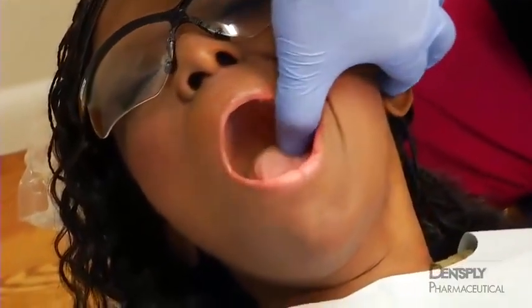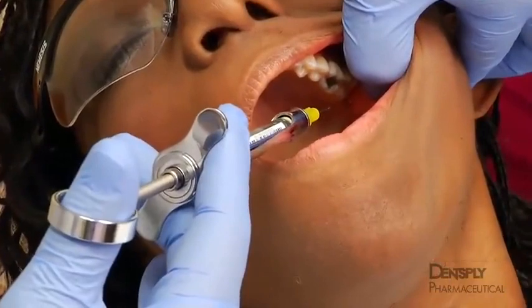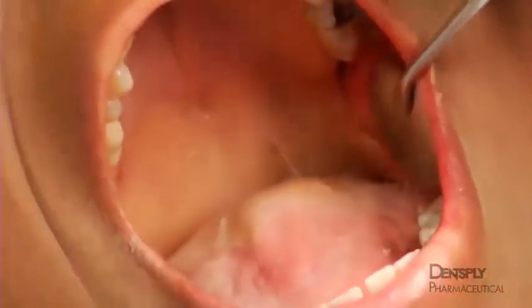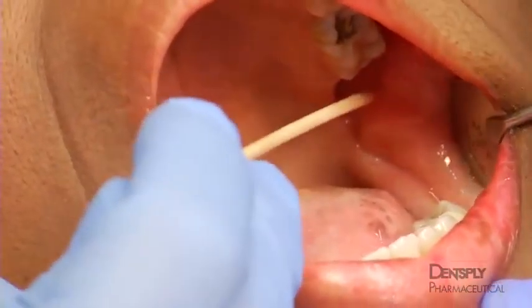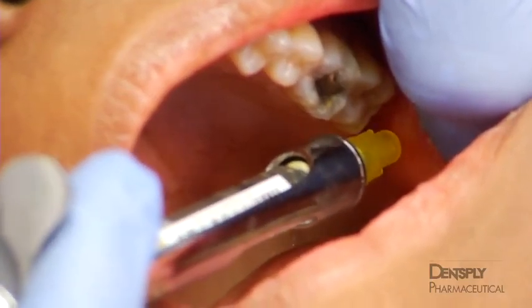With the syringe barrel over the contralateral canine and adjusted mesially or distally, according to the flare of the tragus, the needle is advanced through the mucosa just medial to the previously palpated deep tendon of the temporalis muscle. Normally, the insertion point is slightly distal to the maxillary second molar and at the height of its mesial lingual cusp. A few drops of anesthetic can be injected as the needle is advanced to 2.5 centimeters until bone is contacted.